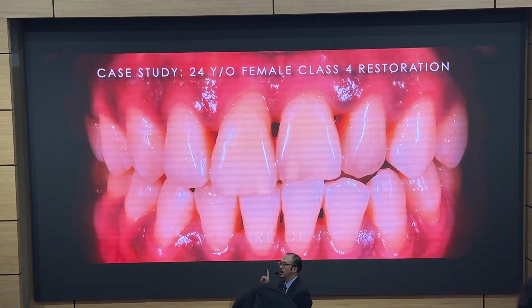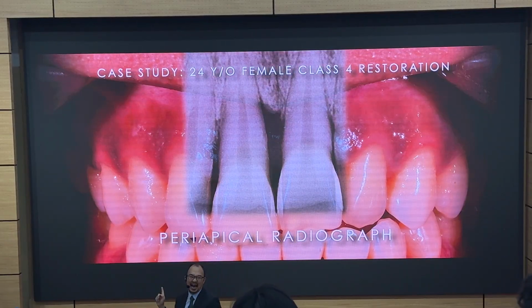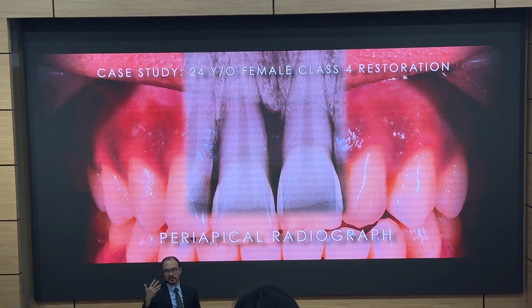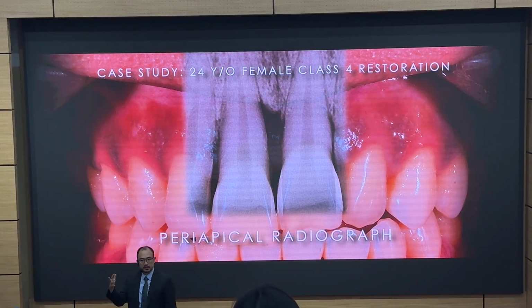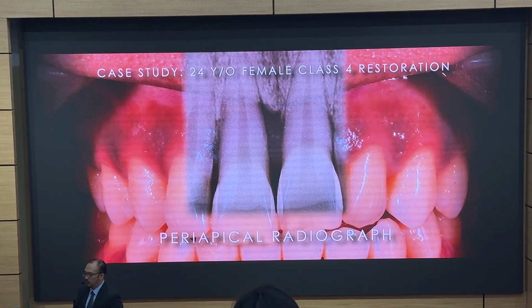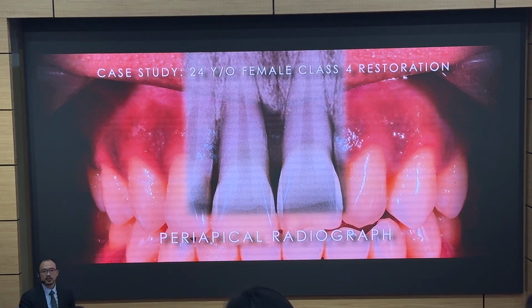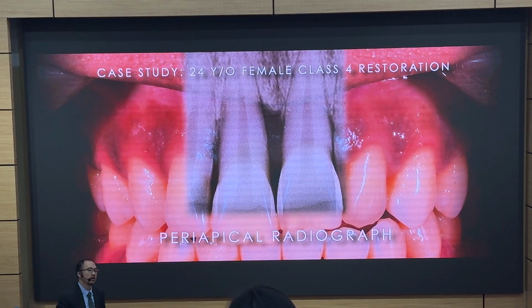I took an x-ray, I realized, oh, okay, she had perio. The bone level is shrinking, but it's stable right now, which is why there's that movement. Now, for this sort of case, one thing that I like to do is basically called direct mock-up.